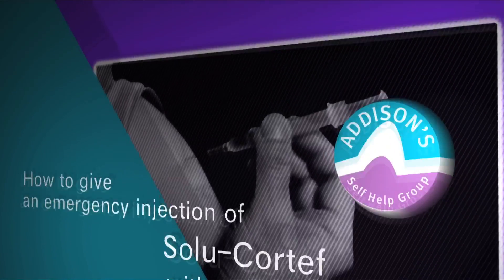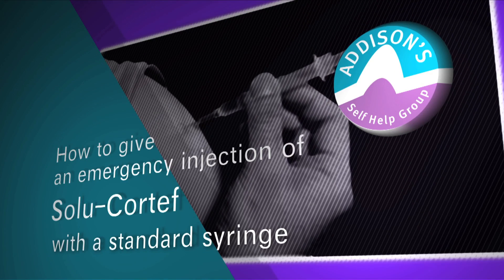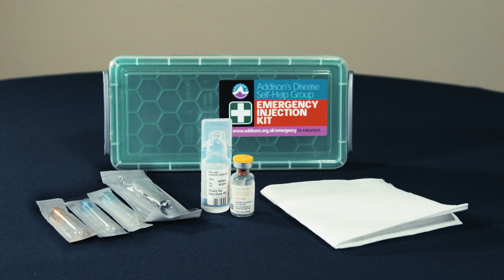This video explains how to give an emergency injection of Solucortef with a standard syringe.